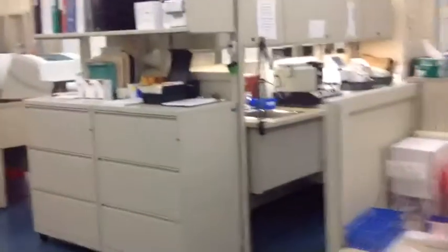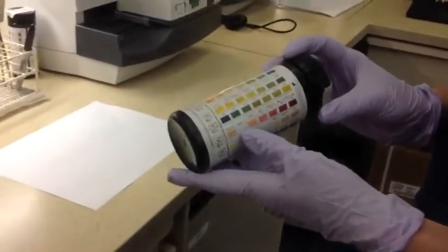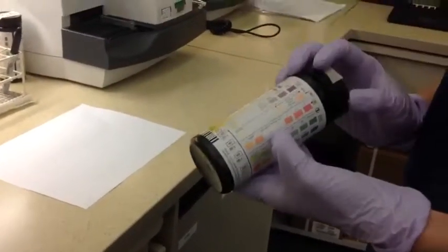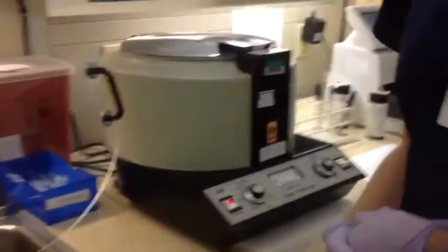This is urinalysis. We do stick testing on the urine. And this will actually show the different things we test for. We do glucose, bilirubin, ketones, blood, pH, protein, and then we also look for white blood cells in the urine. We spin it down in the centrifuge here, and then we look at it under the microscope.